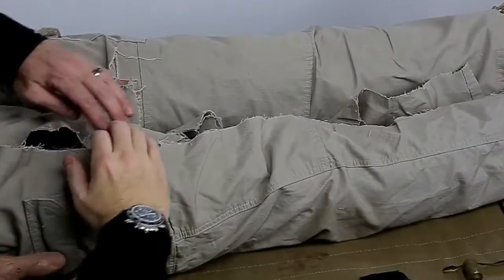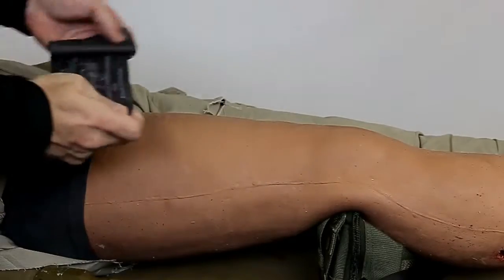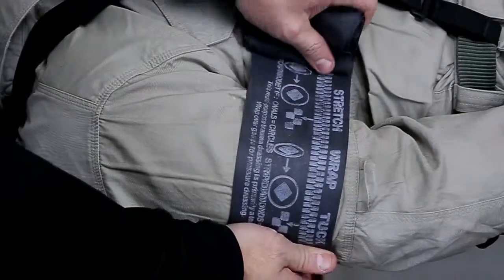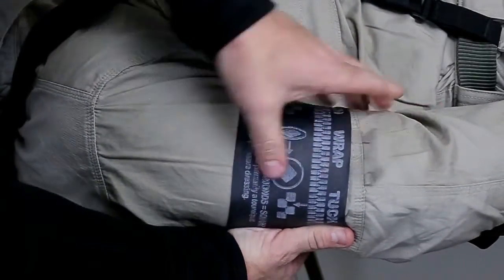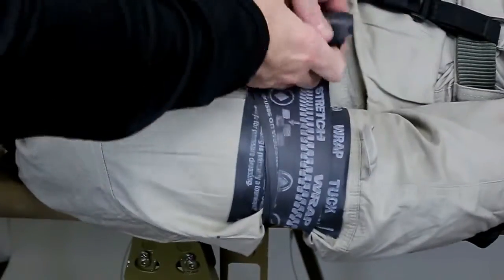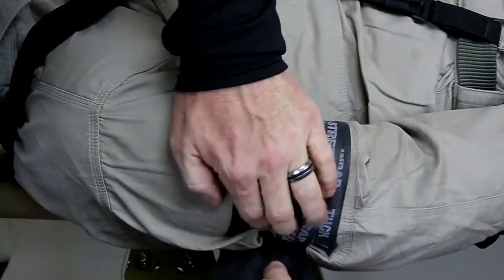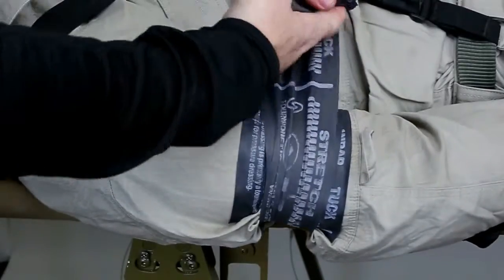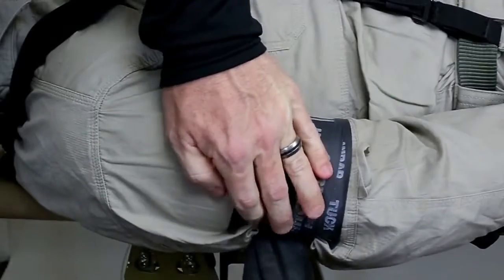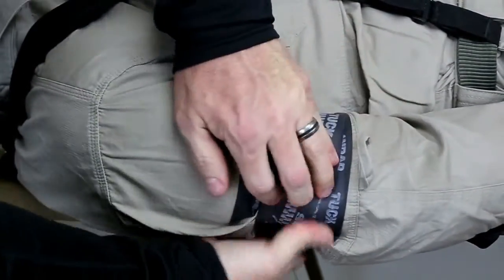Placement. Ideally, you want to expose the limb and visually identify the source of bleeding in order to place the SWAT-T between the wound and the body. In some circumstances, visual identification of the wound location may not be practical. In those instances, the SWAT-T should be placed as high on the limb as possible. Be aware that a patient may have multiple wounds and that careful monitoring should be continued after tourniquet application to ensure that all bleeding is controlled. Always double-check the tourniquet application after you move a patient.